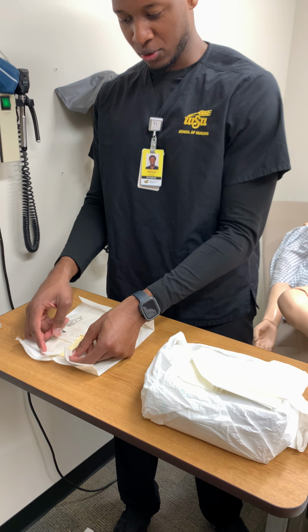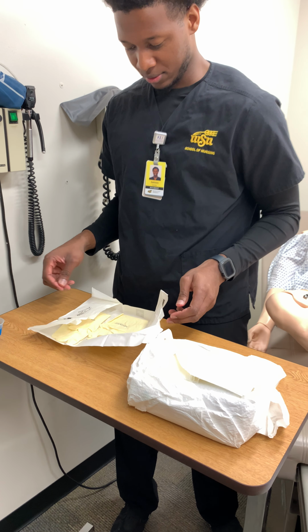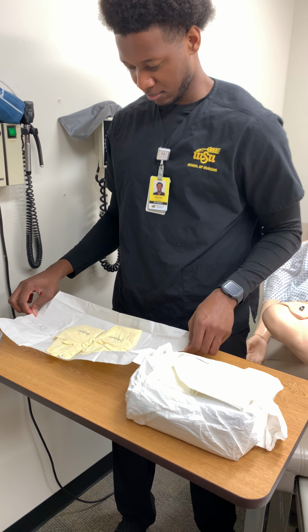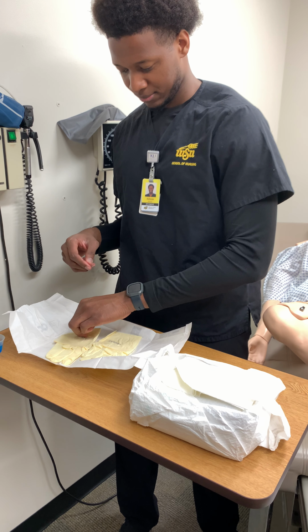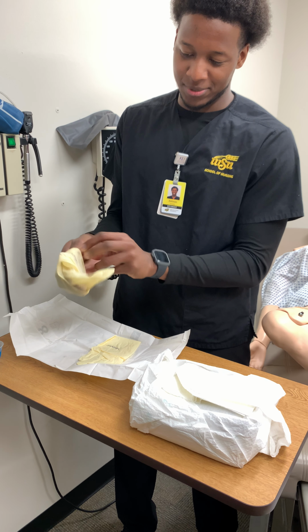we have a 1-inch border. That is not sterile, and that's what we'll use to open it. So I'll start with my dominant hand first. Let's see.